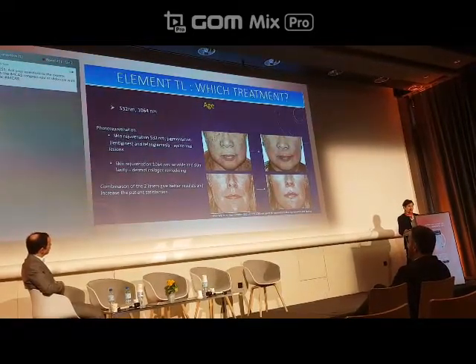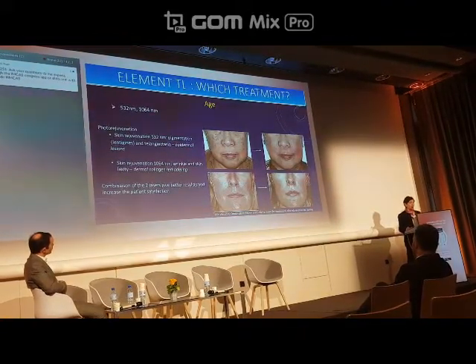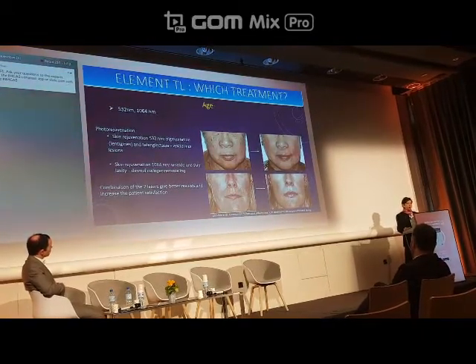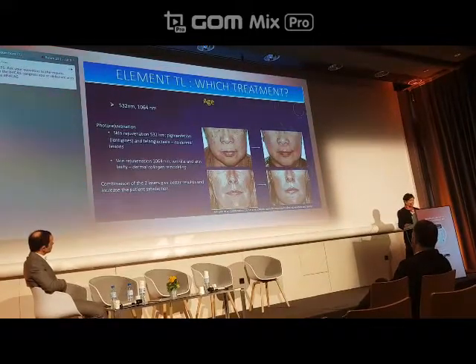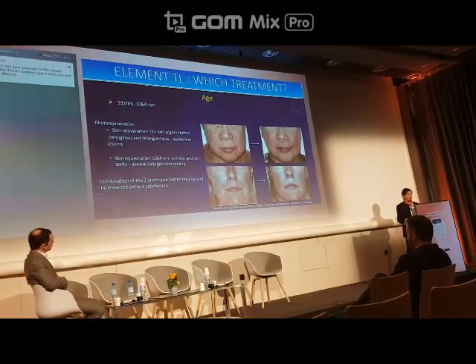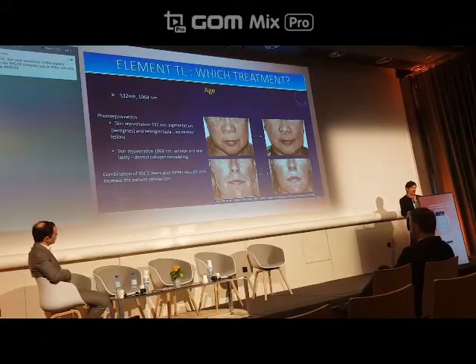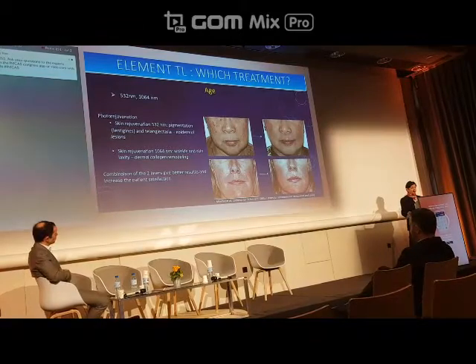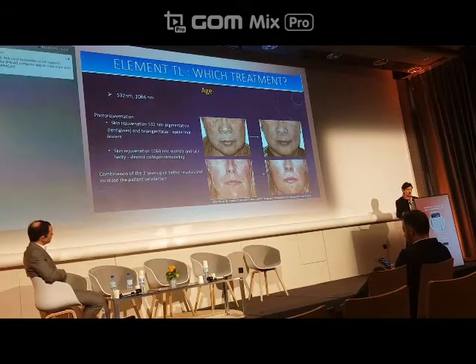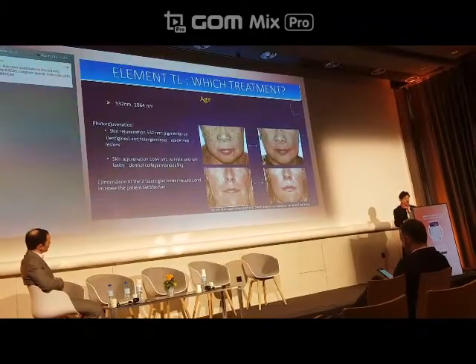And to treat aging, to do photorejuvenation, you can treat epidermal lesions with a 532 nanometer laser to treat pigmentation and telangiectasia, and after you can use 1064 nanometers to treat wrinkles and skin laxity and to do dermal collagen remodeling. Combination of the two lasers gives better results and increases patient satisfaction. You have two examples of patients treated with a combination of the two lasers, and it's non-invasive.